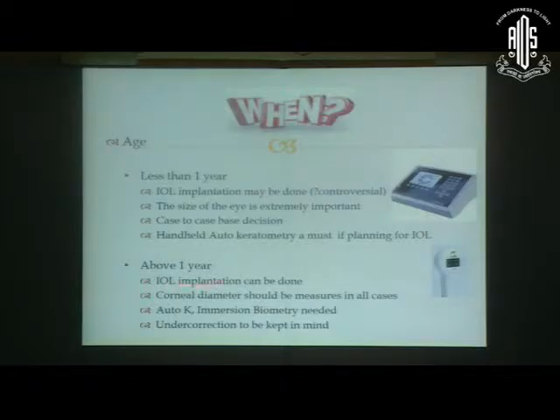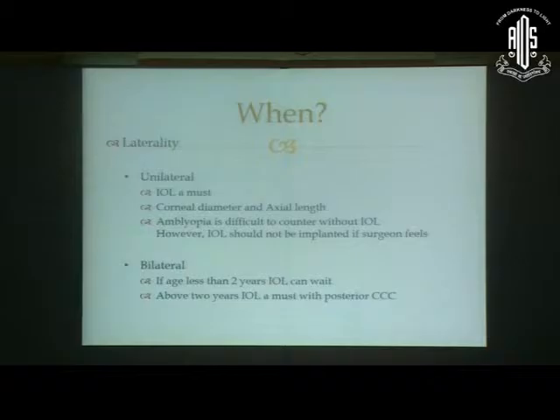Above 1 year, IOL implantation can be done. I normally do it. Corneal diameter should be measured in all the cases, as we were taught. Auto-K and immersion biometry are needed, and under-correction has to be kept in mind. We will take it up when it comes.